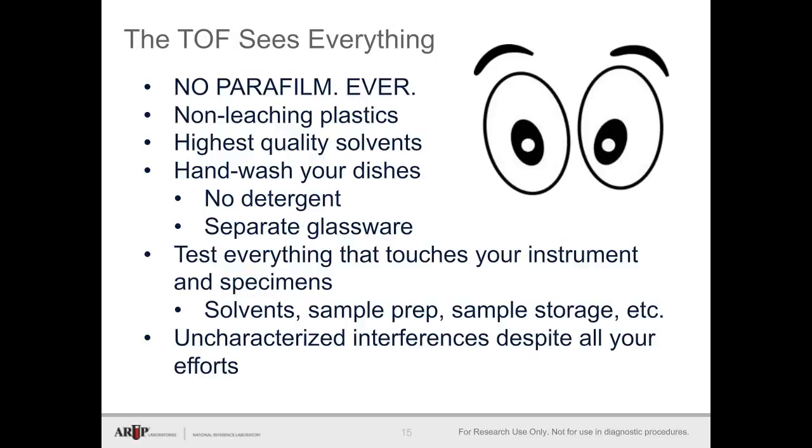The highest quality solvents need to be used on board the instrument. We use Optima-grade methanol and acetonitrile and Milli-Q water in our laboratory. We've tested the lower grade stuff and it just causes problems. Hand wash your dishes. Detergents will show up in this signal just like parafilm will. We've found that it's best to keep a separate set of glassware for TOF-related preparation.